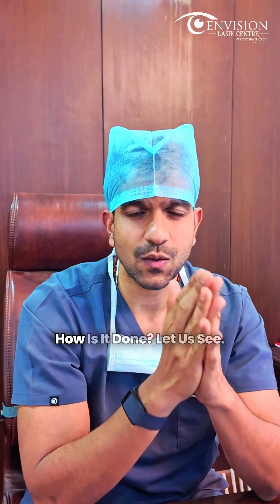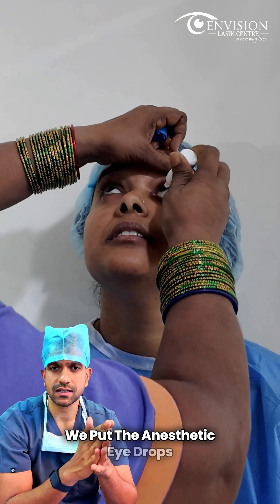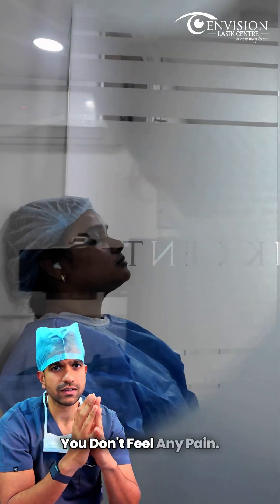Step by step, SMILE eye surgery — how is it done? Initially, we put anesthetic eye drops so the eye becomes numb. Throughout the procedure, you don't feel any pain.